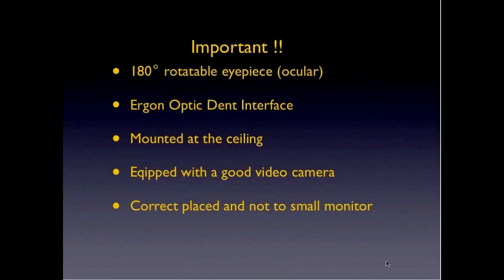Without the camera, you cannot instruct your assistants, you cannot show anything to the patient. And when you have a camera, you also need a monitor so that you, or your assistants, can look at it.